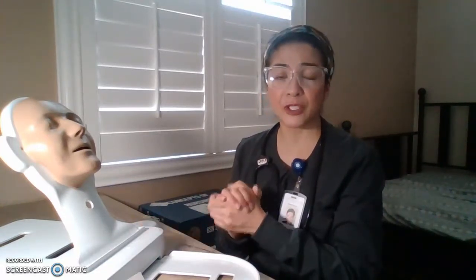Okay, and also let's say you've confirmed the orders from the physician. You visually inspected and checked your patient, you have to let them know and get their consent before anything else. What if you have a lot of patients within the day and you gather all your supplies, so you've already lost time and effort, so you have to work smart.